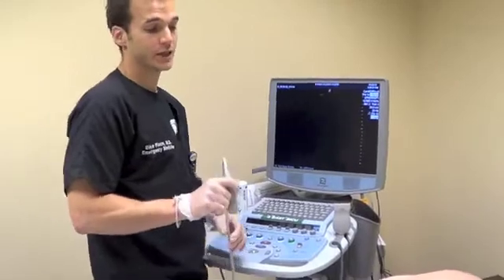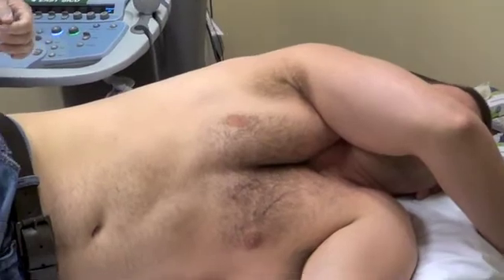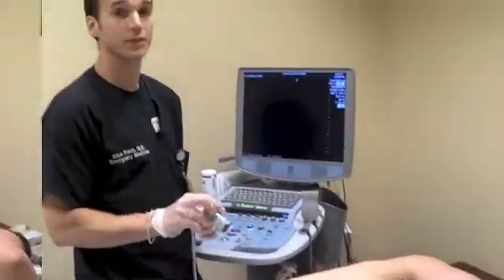It helps to place the patient in the left lateral decubitus position. However, doing it in a supine patient certainly is alright as well.